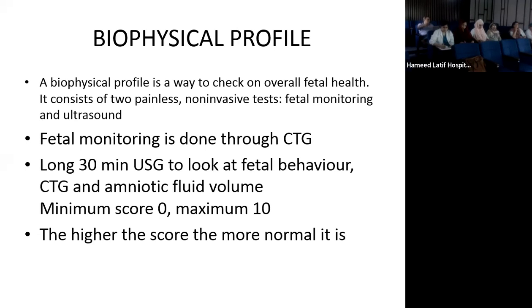Rub your fingers against the scalp of the baby after you've done the ARM. No, the trace, son. What will happen as soon as you do that for 25 to 30 seconds? It will revert. Acceleration should come.